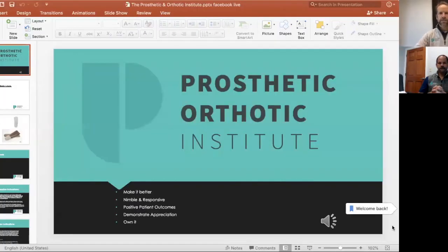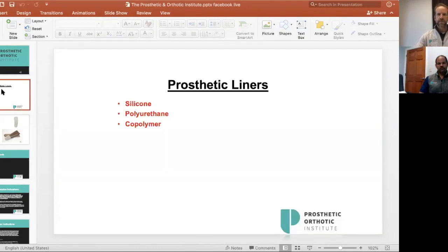I'm going to share a screen here, that presentation that we have created, that you created actually, to talk through some of this. So first off, we talk about the liner. Explain the liner and why it's important, what it does, what its function is.